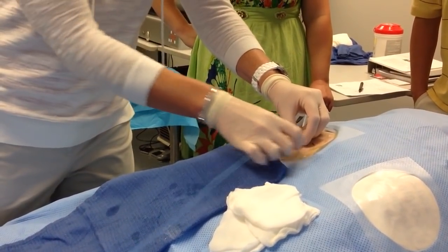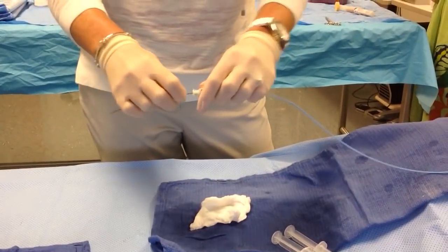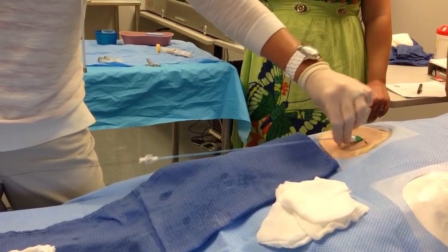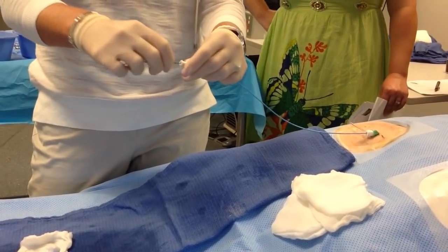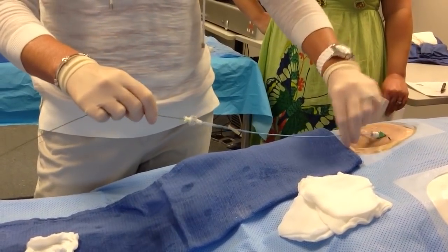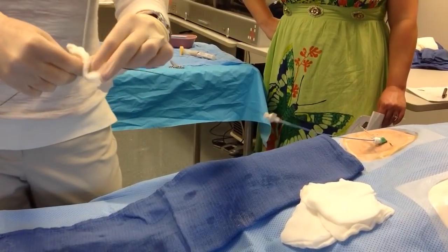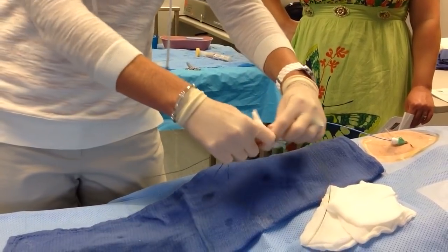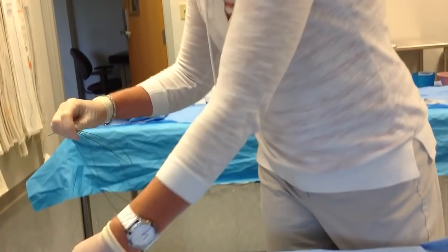So now remember with the pigtail, we'll do the same thing. Guide wire should be in front, but once the pigtail reaches the guide wire over the arch, then you let go of the wire, because then the physician's going to take both and they're going to manipulate it across the valve into the LV. Once the pigtail gets into the LV, you can take this out. When you have a normal wire, it's easier.